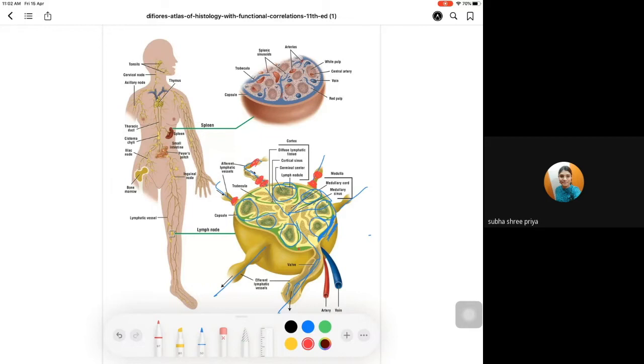So, if they sit outside, they are not lymph node involvement. They have to come inside the subcapsular sinus to call it metastasis. So, when you see only tumor cells in the lymphatics outside the capsule or just at the capsule, you have to take deepers to make sure whether they are coming into the lymph node or not.